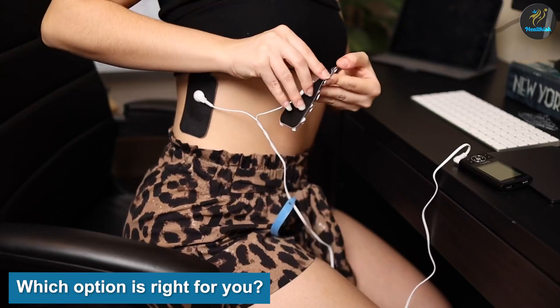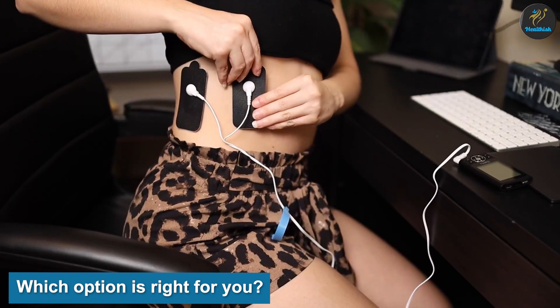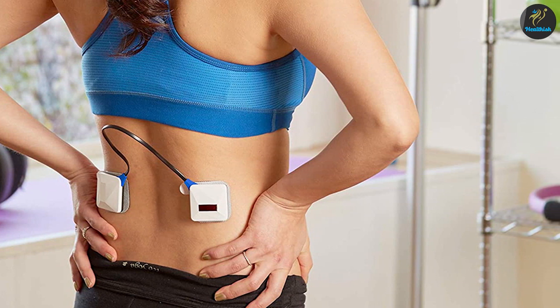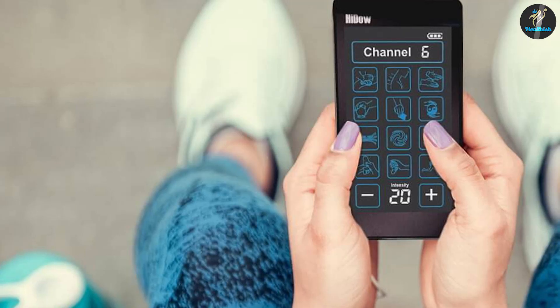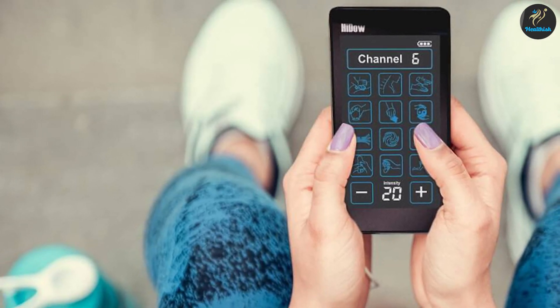Which option is right for you? If you want to treat pain, a TENS machine might be helpful. An EMS unit may be beneficial if you are recovering from surgery, or under the direction of a physical therapist, to improve muscle contractions while working out. Before shopping for either device, talk with your healthcare provider or physical therapist. They may be able to recommend a product or, depending on your health status, offer advice on other options.